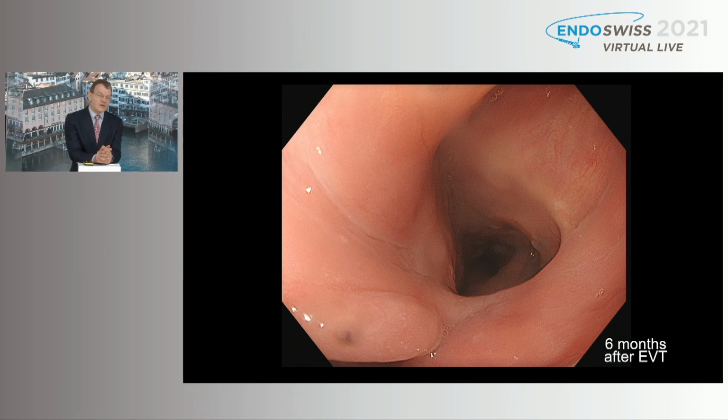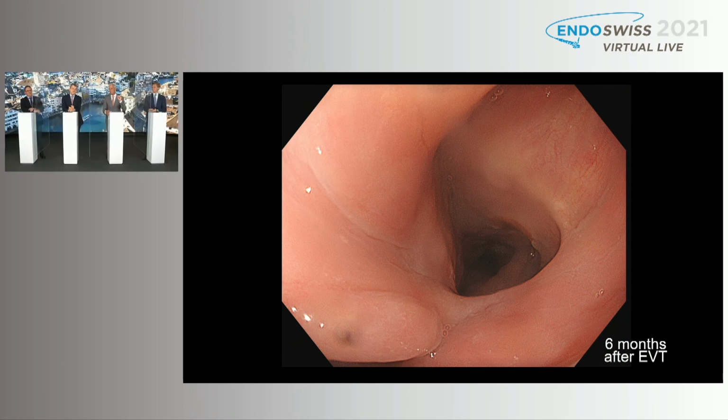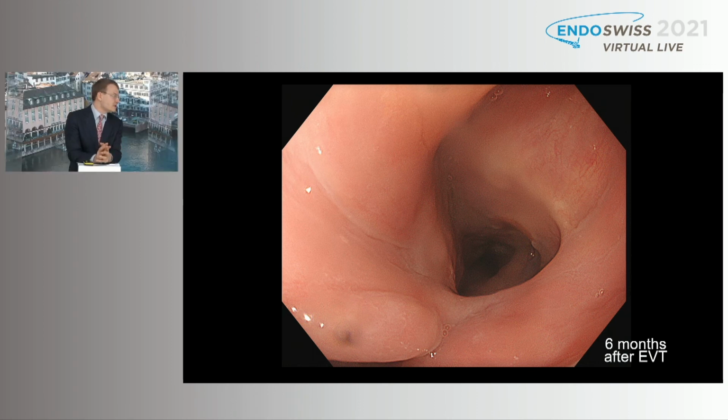I think sometimes you have a small remaining cavity with granulation tissue. In this case, the patient may already drink water, but I think then finally this small defect closes by itself. So you just try to reduce the size of the sponge at every sponge exchange until you can't get the sponge in, right? Yes. You will get to a point where you cannot place a sponge anymore.